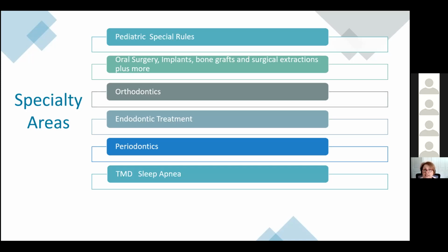The other thing they're using it a lot for is bone grafts. In order to do bone grafts, you have to be very specific. You have to know the level of bone loss. You have to know whether or not there are teeth left to be savable in that quadrant. And if not, what are you going to do? Which would go back to, now, why do you need the implant? So there's a lot of reasons for it.